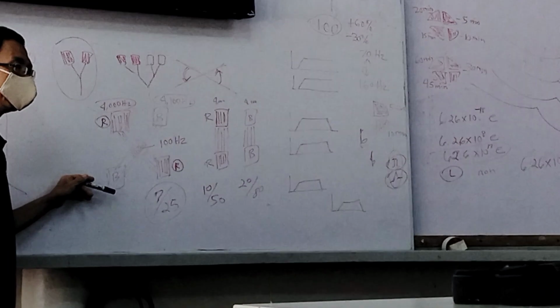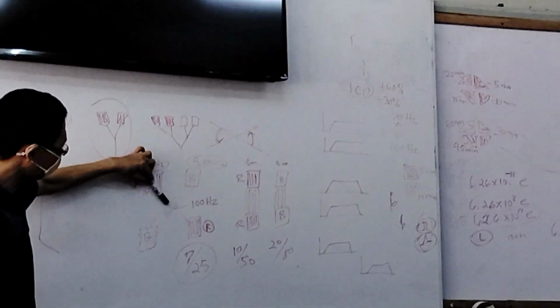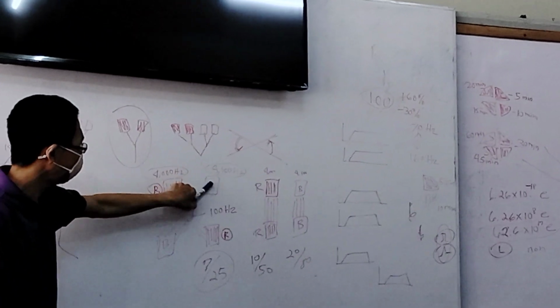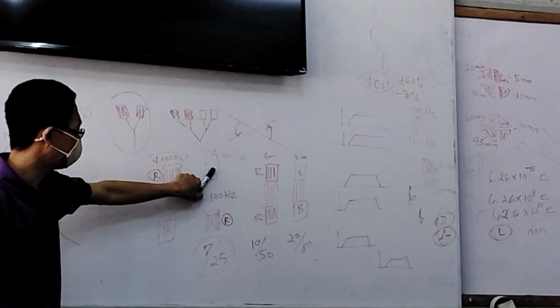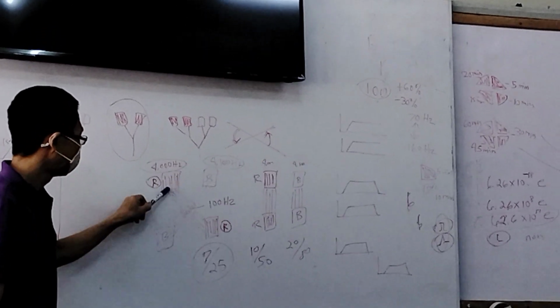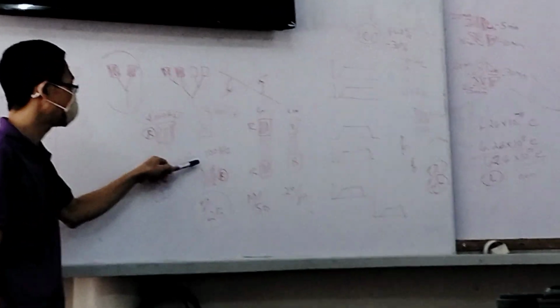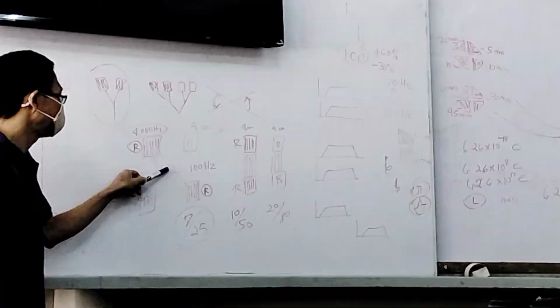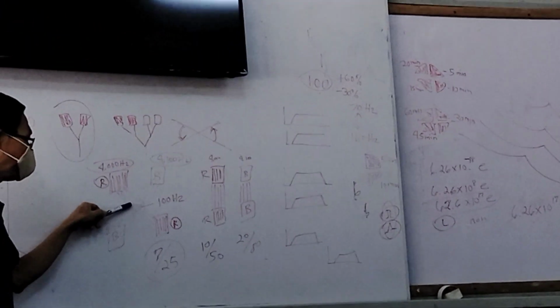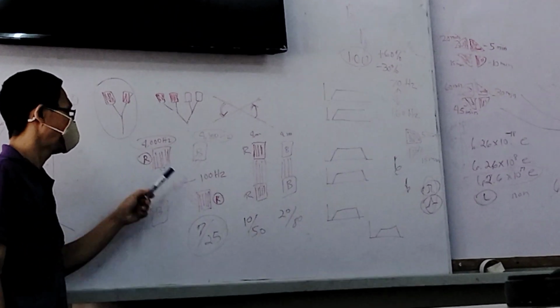So that when you turn it on, you expect that the current produced by the red will cross towards the other side, and the current produced by the black electrode will also cross towards the other side. Therefore, the currents produced by the 2 pairs of electrodes will intersect and interfere, producing a resultant frequency.